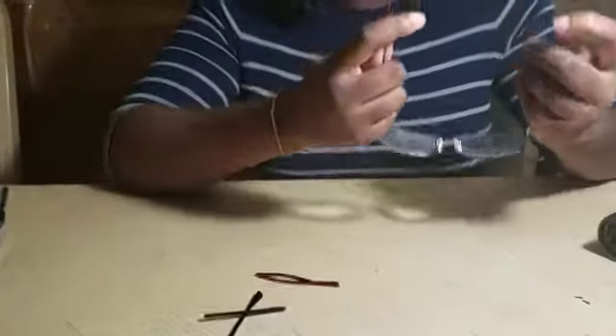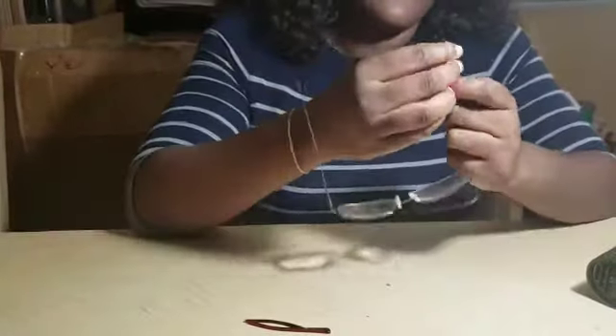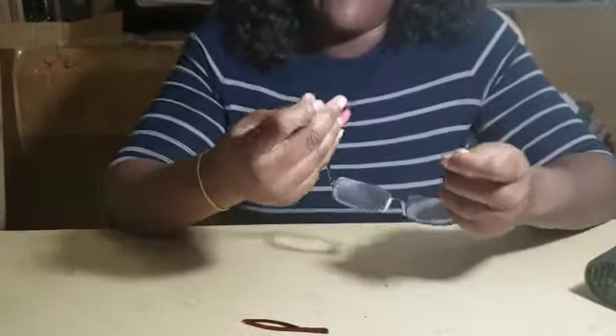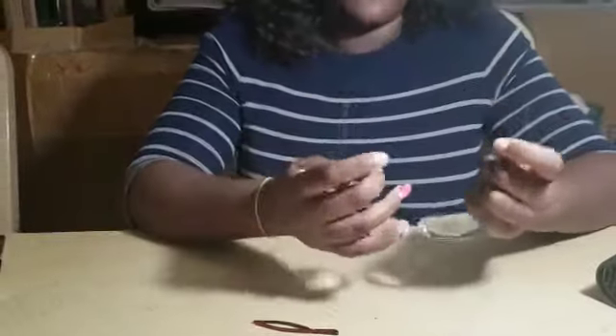Now that we have them pulled off, make sure that the temples are straight. There may be a little bit of gunk on there, so you want to remove that excess gunk and make sure that it's straight.